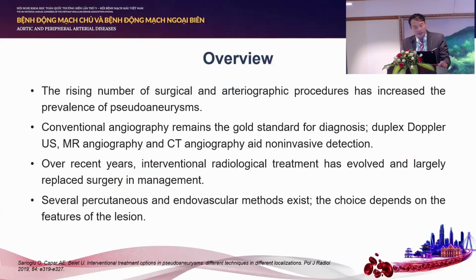The rising number of surgical and arteriographic procedures has increased the prevalence of pseudoaneurysm. Conventional angiography remains the gold standard for diagnosis, with Doppler ultrasound, MRI angiography, and CT angiography as non-invasive detection. Over recent years, interventional treatment has evolved and largely replaced surgery in management. Several percutaneous and endovascular options exist, the choice depending on the features of the lesion.